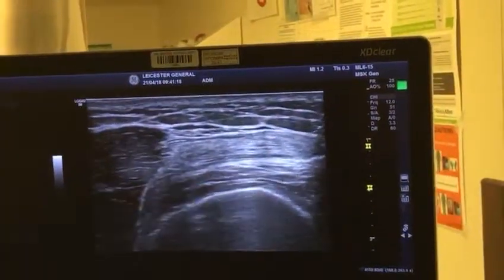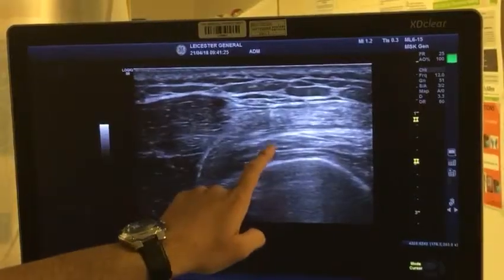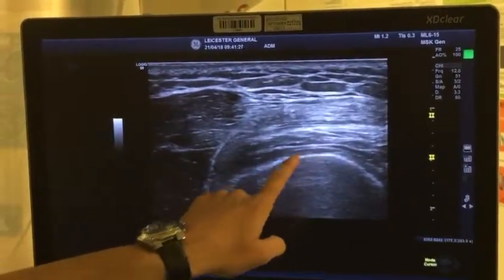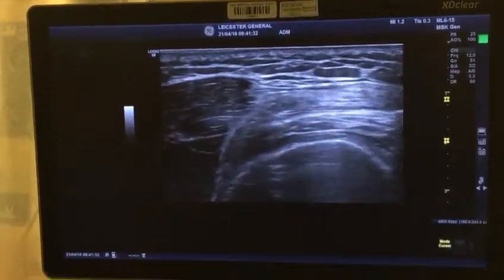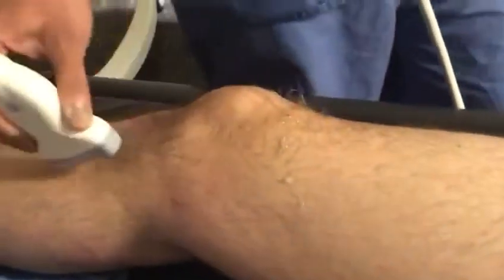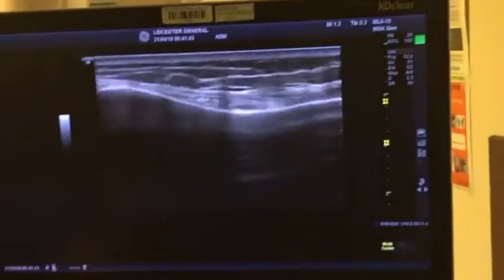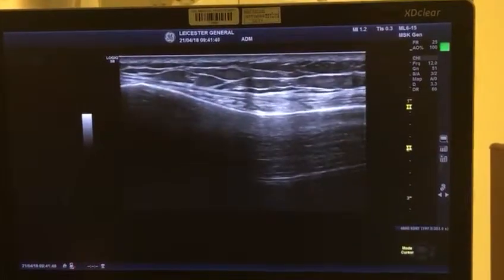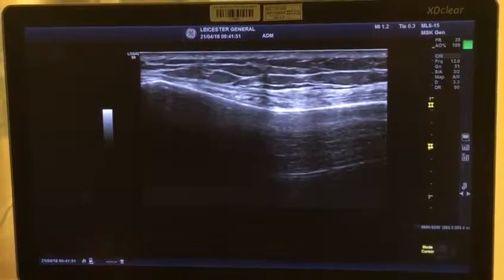For the intermediate genicular nerves, you look for the quadricep tendon and come underneath it. Bring the needle from lateral to medial on top of the femur — this is the pre-femoral fat pad — and go underneath the quadricep tendon. For the infero medial, it's very similar: look for the tibial condyle and tibial shaft, find the arterial pulsation there, and that's where you do the infero medial genicular nerve.